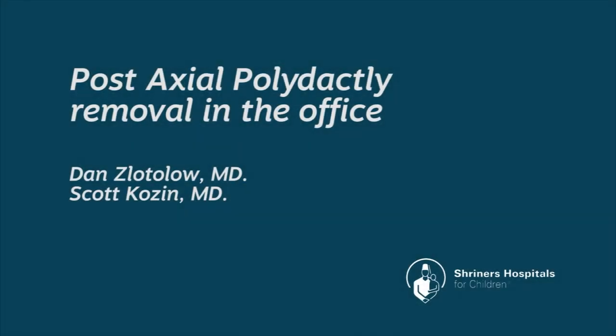We therefore prefer post-axial polydactyly removal in the office, in a technique that was described by Peter Carter at the Texas Scottish Rite Hospital for Children.